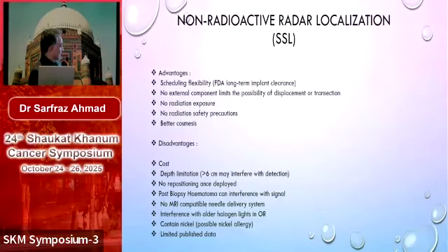You can't reposition it once deployed. Post-biopsy hematoma can interfere with signal. There is no MRI compatible needle delivery system, and interference with older halogen lights in the operating room. It does contain nickel and there are possible nickel allergies. There is limited published data yet.